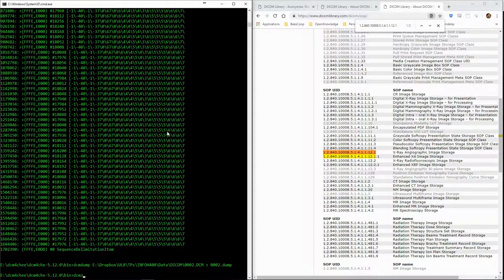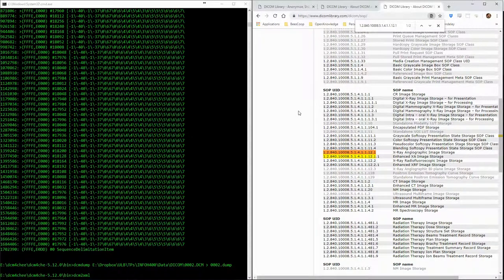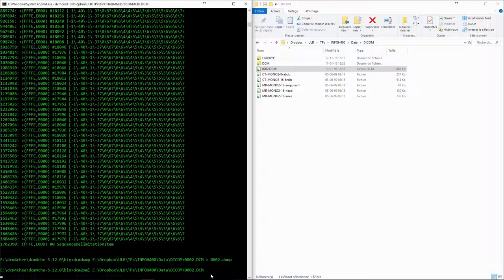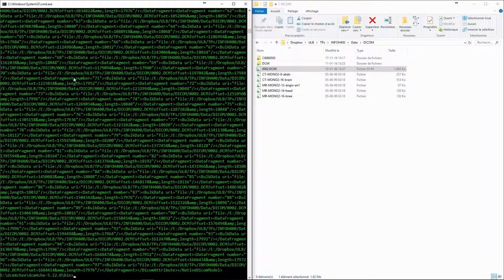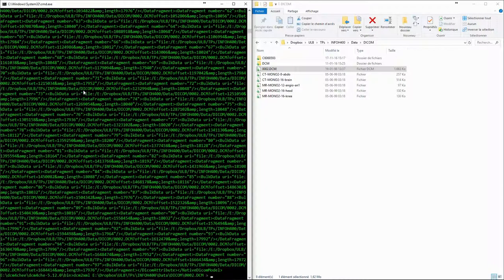Another thing we can do with DCM4CHE is to export the DICOM file to the XML format for the metadata. This will produce XML tags, which we can also save to a file.